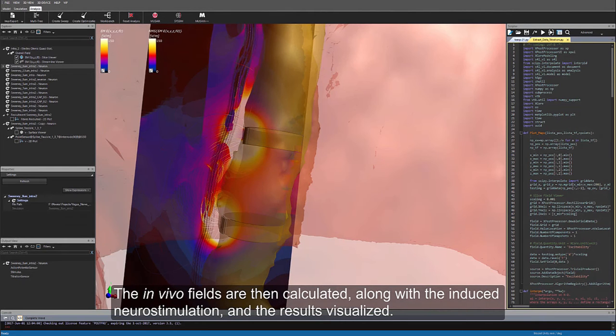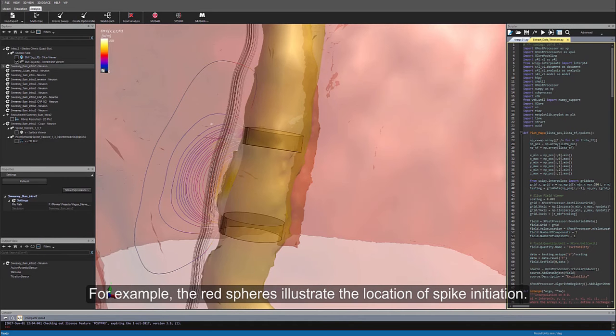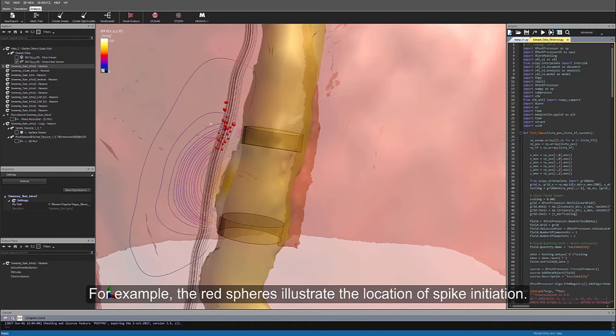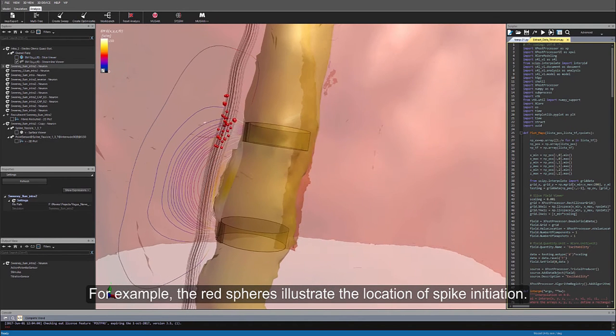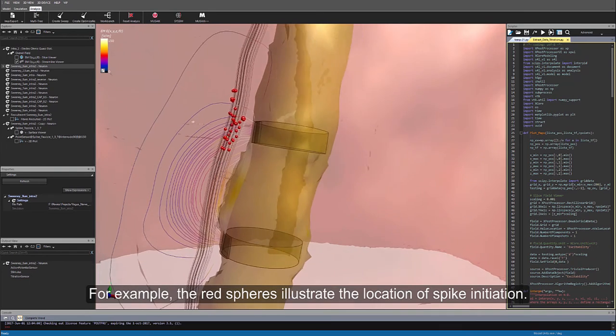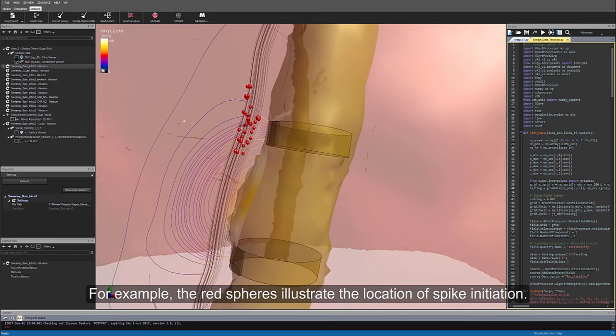induced neurostimulation, and the results visualized. For example, the red spheres illustrate the location of spike initiation.